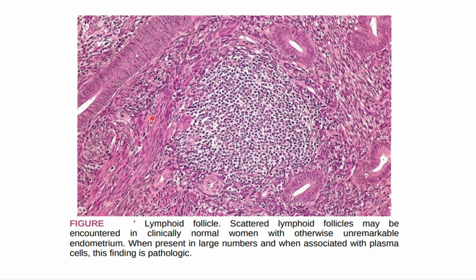So here you can see the stratum basalis containing a lymphoid follicle. This is a normal finding in the stratum basalis.